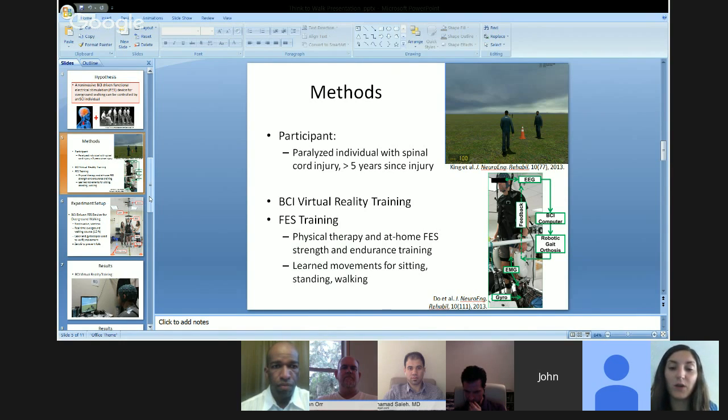However, the focus of this talk will be the functional electrical stimulation device that we created. We performed the BCI virtual reality training, as well as a functional electrical stimulation training, where he had a physical therapist perform sit to stand and walk again using the device, as well as at-home functional electrical stimulation strength and endurance training. Since he's 5 years post-injury, it took a bit of time to get his muscles strong enough, as well as to be able to withstand the FES stimulation for a long period of time.